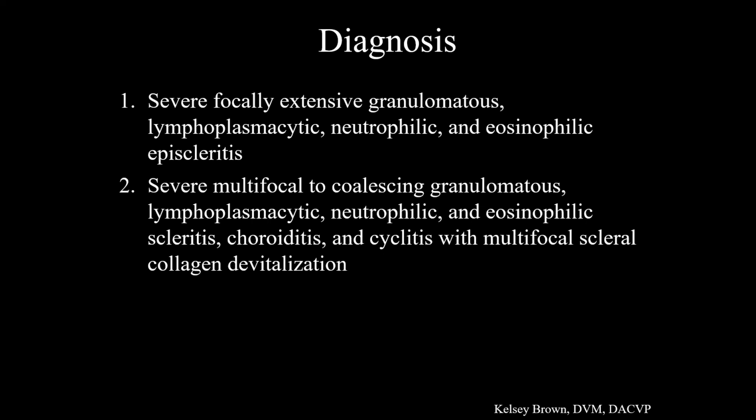So it's kind of an interesting one where we saw these two conditions in the same eye. And maybe there's kind of overlapping features of a similar underlying mechanism. The bottom line for this is that we do strongly suspect this is an immune-mediated etiology. There's no evidence of infectious disease in this case. For at least granulomatous or necrotizing scleritis, that can be a bilateral condition. In this case, they say the other eye is normal, but we just recommend keeping a close watch on that other eye just in case this dog does develop a bilateral manifestation of this immune-mediated disease. So kind of just an interesting case, a weird one that we looked at pretty closely.